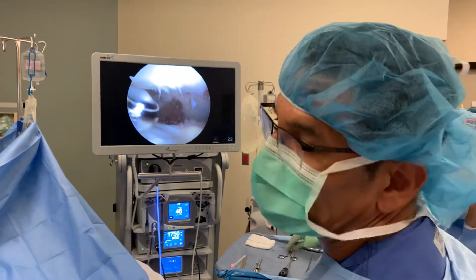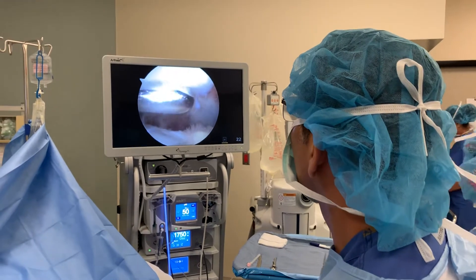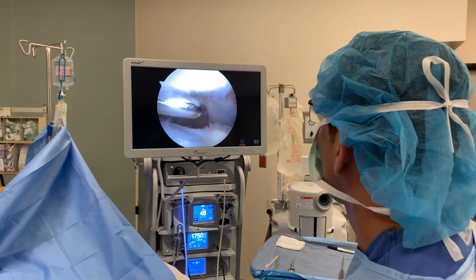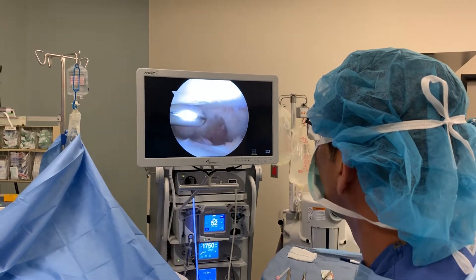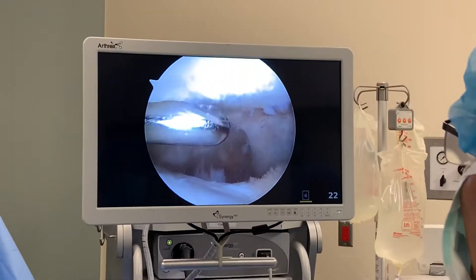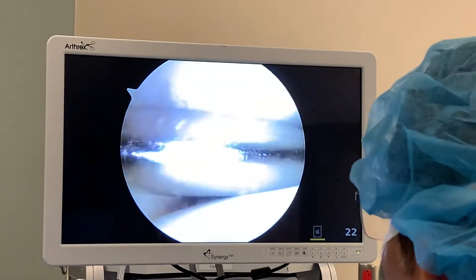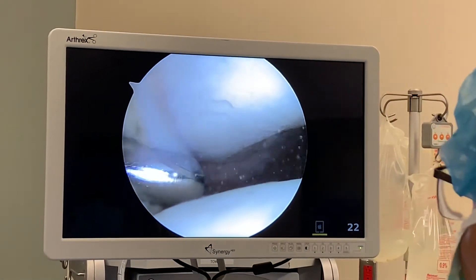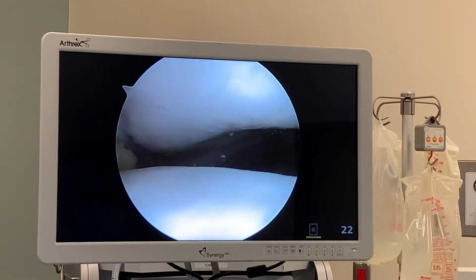We're at the home stretch here of a simple knee arthroscopy, just cleaning up a little bit of the knee cap — a little minor chondromalacia right here — smoothing it out on our very active gentleman. I already did the partial medial meniscectomy, cleaned up a little bit of his lateral compartment. We discovered why he may be having some pain in other areas: the patellofemoral joint.